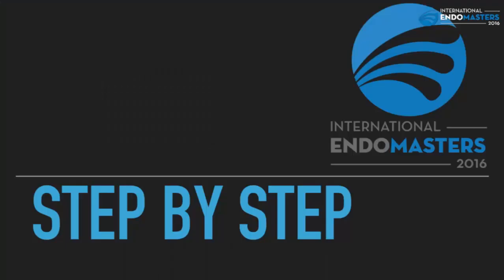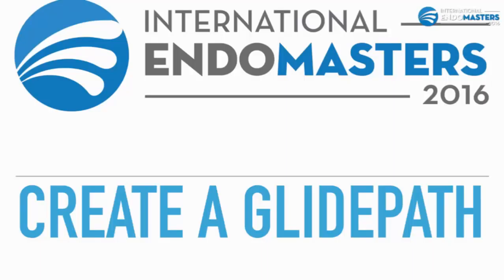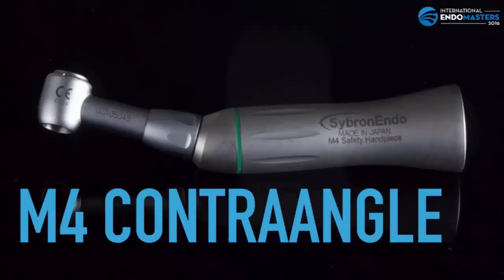We are going to see step by step how to use the instrument. The first step is create a glide path. For this purpose, we are going to use the M4 contra-angle.